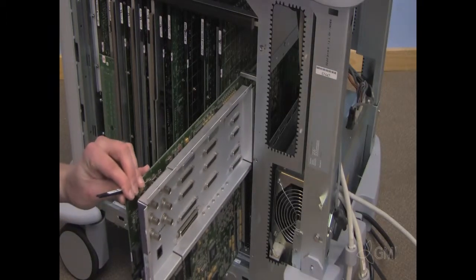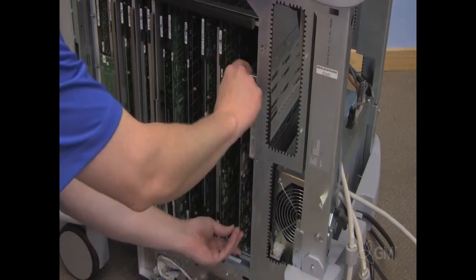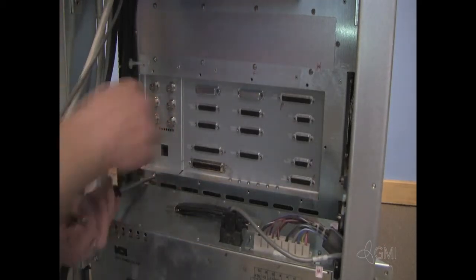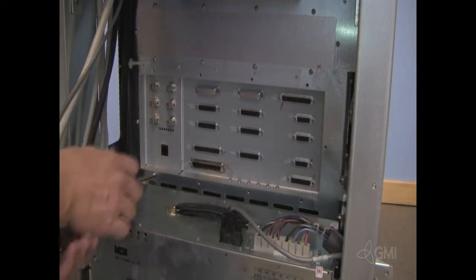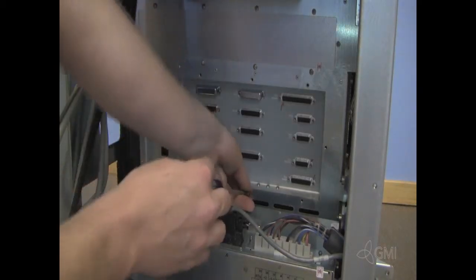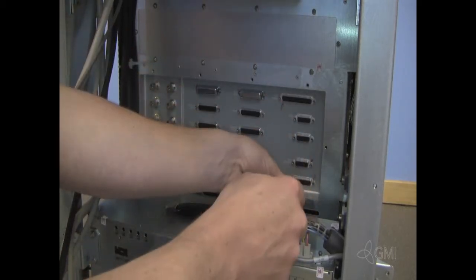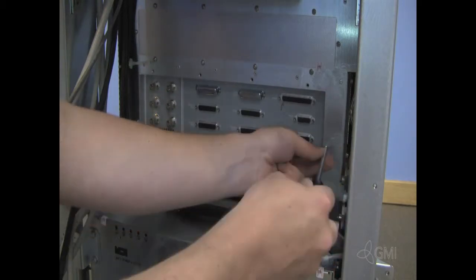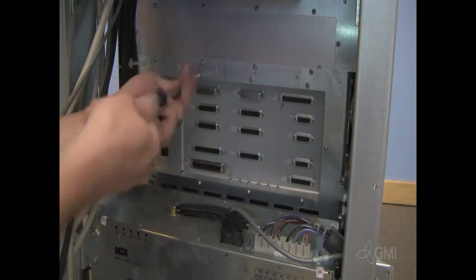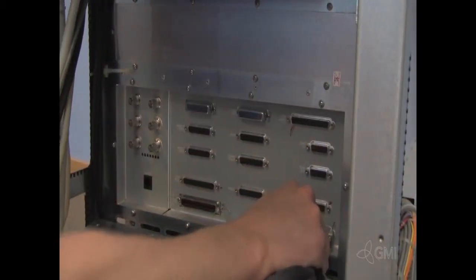Install the new PIC. Use the pull tabs to lock the PIC in place. Reinstall all the screws securing the PIC to the chassis. Reinstall all the cables.